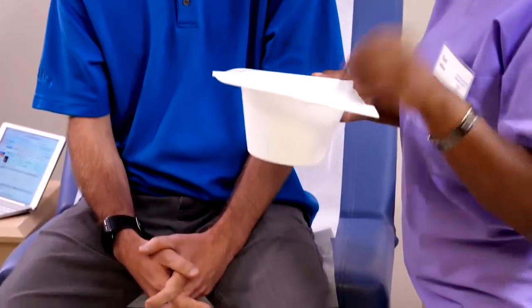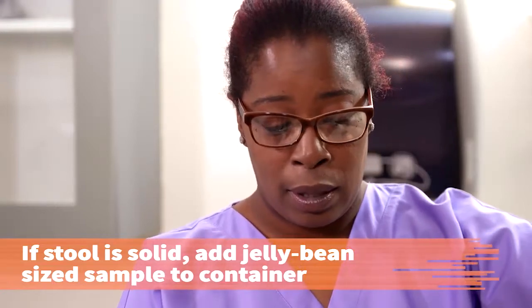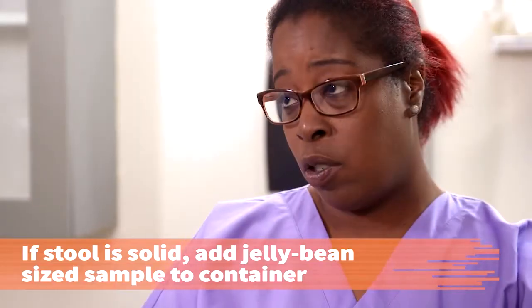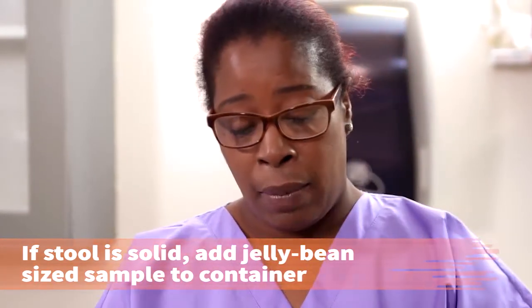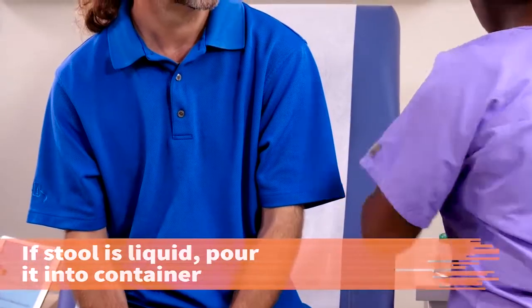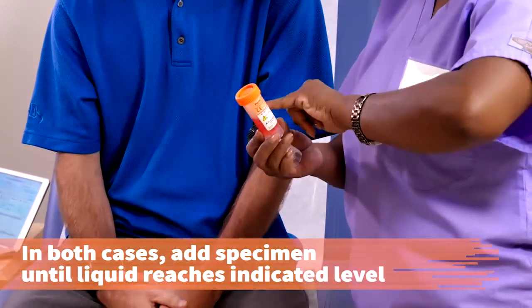Instruct the patient to add stool to the collection vial or vials. If the stool is solid, he should use the scoop on the lid of the container to add a large jelly bean-sized piece of stool to the liquid in the vial. And once you do that, you will have this container, and then I will also give you a spoon, or you can get your own spoon, to be able to get the sample out of the hat to place into. If the stool is liquid, pour it into the container. In both cases, keep adding the specimen until the liquid preservative in the vial reaches the indicated level.